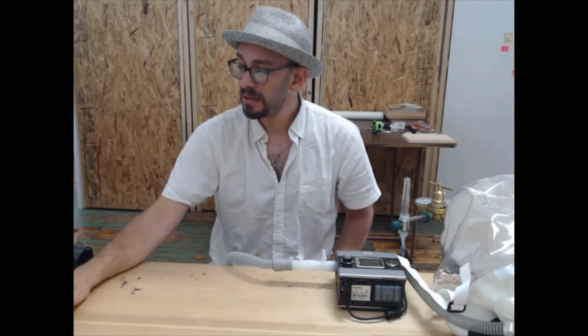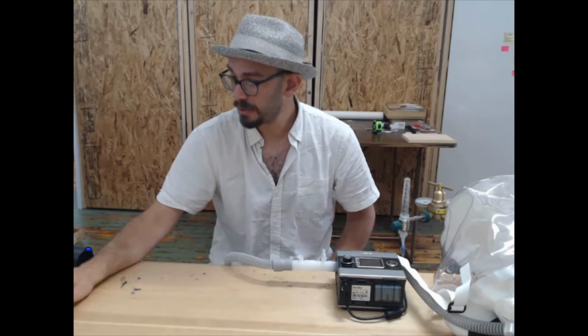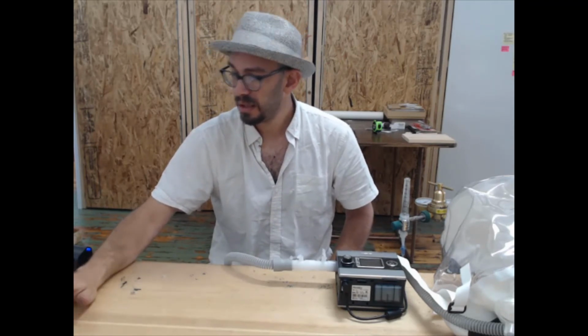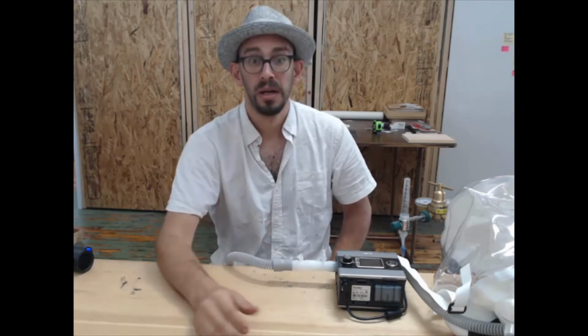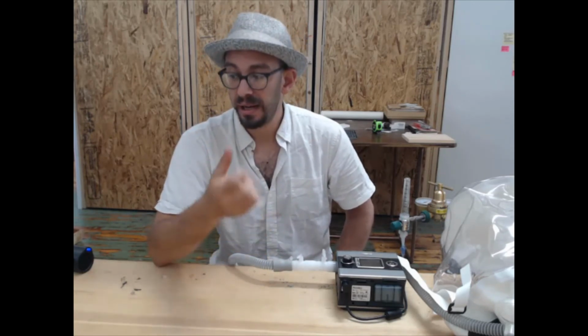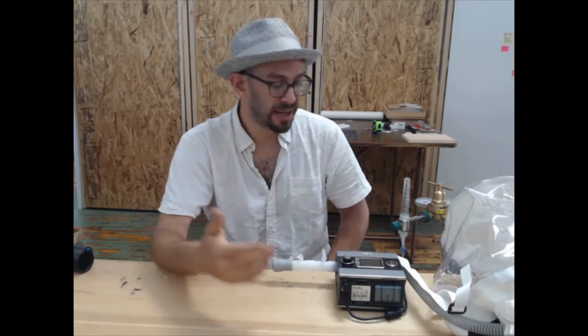The final thing we need to do is to set our oxygen flow. So I'm going to go back to the table. I need an oxygen flow of 27 liters a minute, and so I set that right here. And now my patient is receiving their treatment parameters, 5 centimeters of water pressure, 50% FiO2.